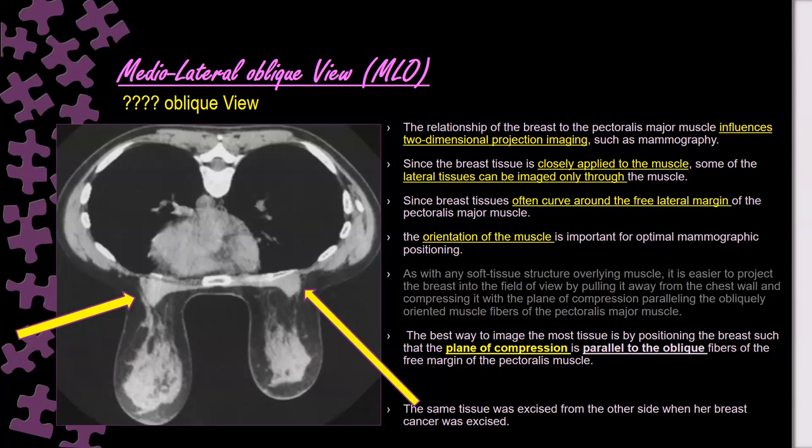Because at this side most of the cancers are present. The most excellent, well done. The location, yes, to make the lateral aspect close to the detector, okay? So it will improve the visualization of the lesions. This is one issue, because this is the maximum location for breast cancer.